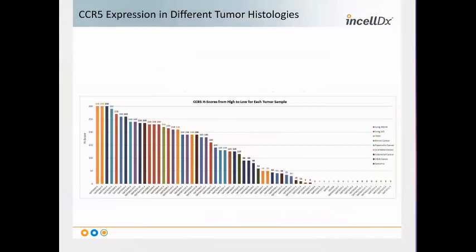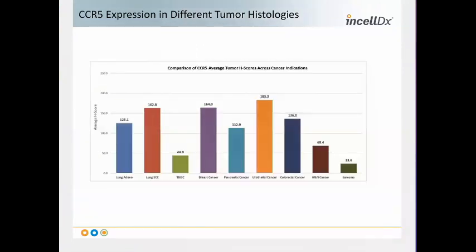I'll finish with that, but in fact, we can apply the same technology with the same antibody manufactured by us and labeled by BioLegend to do CCR5 expression without antigen retrieval, so that we can see in cancers the level of CCR5 expression as this comes to bear in terms of being an immuno-oncology drug to inhibit Tregs and repolarize macrophages from a pro-inflammatory, pro-tumor phenotype to an effector macrophage phenotype.